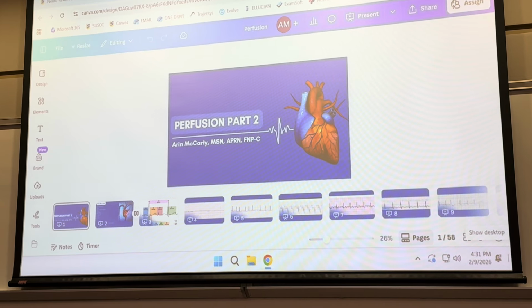Well, over the past week or two, while we've been doing clinicals, it's come to my attention that we're a touch rusty on EKG rhythms, EKG strips. Since they're going to be on the exam anyway, because of old content, you're going to get one or two EKG strips on there every single time. We're going to do a quick review, just to hit the highlights and make sure we're all okay. So if I was a good nursing student in Mr. Riccardi's night cohort class, I would probably look at EKG rhythms before this next exam, okay?